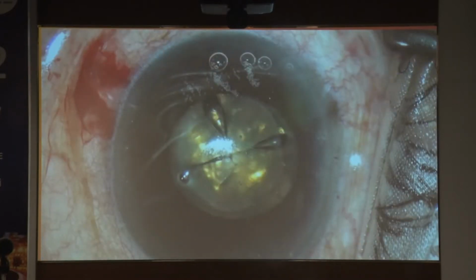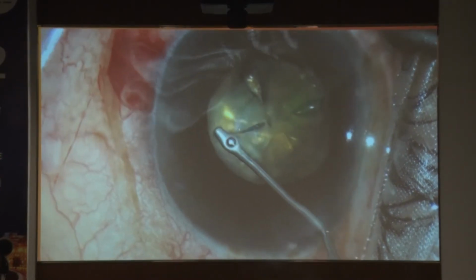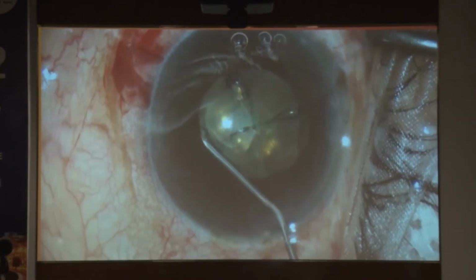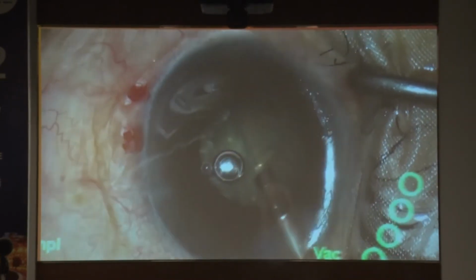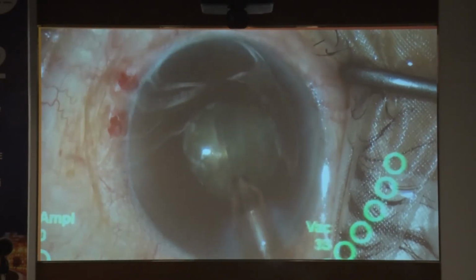And here is the case where we have done a femtosecond laser capsulotomy for this patient. This patient is again taking prostatic medication. He's taking Flomax, and we know that this pupil is not enlarging very well, but we managed to get a 4.5 rhexis, and we know he's going to have intraoperative miosis. So here you can see your CCC is almost close to the edge, and even that minor touch to the iris is going to cause the pupil to contract, and as you can see, the pupil is going to go small.